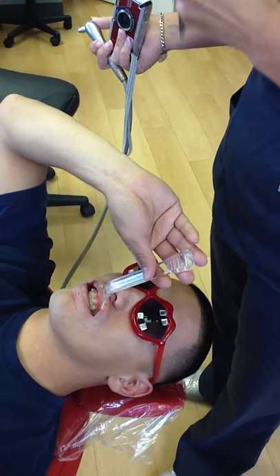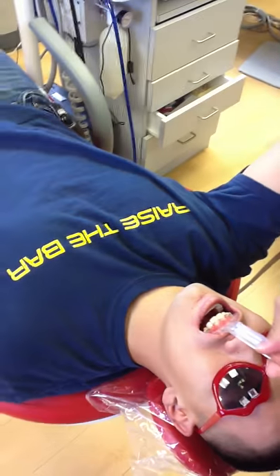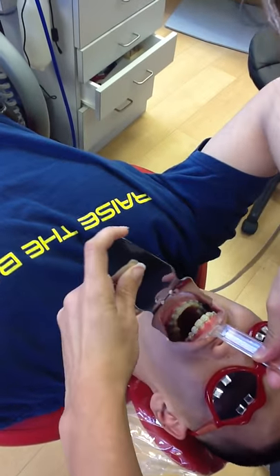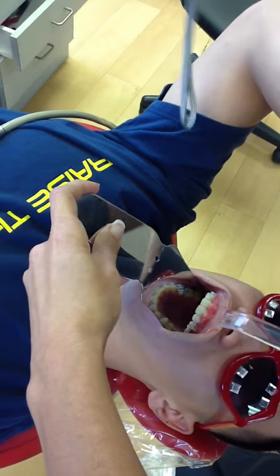We are taking the intraoral pictures that we do at every appointment so the patient can watch their progress. You're going to start with the upper occlusal. Make sure it's not foggy — you can ask them to hold their breath.